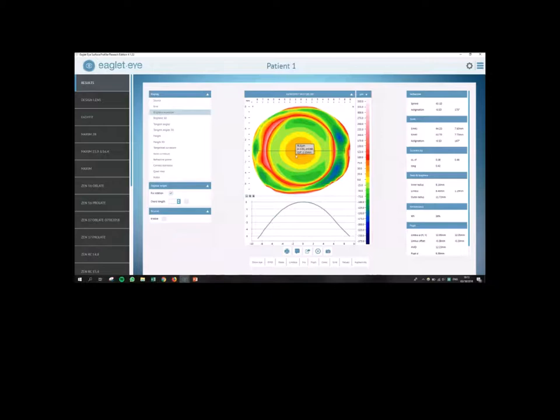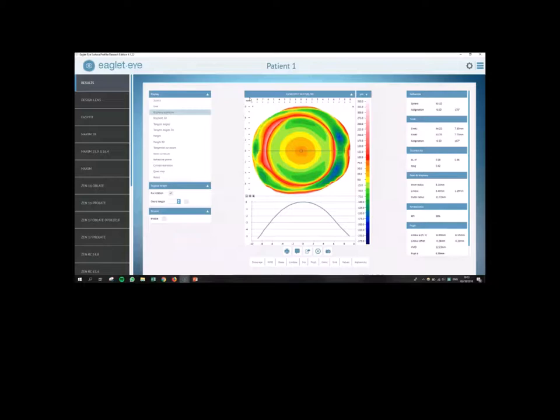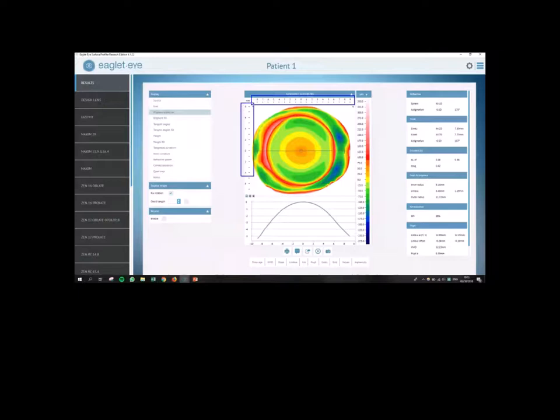So just to give a quick overview of this image, everything that's red is more elevated, everything that's green or blue means it's more depressed. So if you have an image like this, there are a couple of things you want to look at. The first thing is you want to see how the scaling is up here. So as we see, we've got an image of about, let's say 18, 19 millimeters wide.